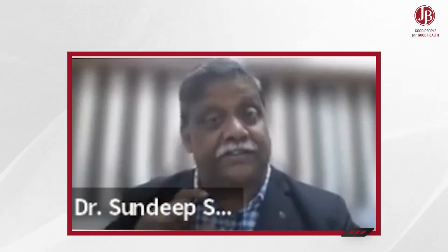Now, FVC is the same as that of a normal healthy individual. So FVC does not change much in patients with mild or moderate disease. But see what happens to the time scale over here. The volume of air that you remove in the first 1 second is now this one, FEV1. Volume of air removed in 2 seconds is this, 3 seconds is this, 4 seconds is this, 5 seconds is this, 6 seconds. So the two things that I'll ask you to keep a close watch.